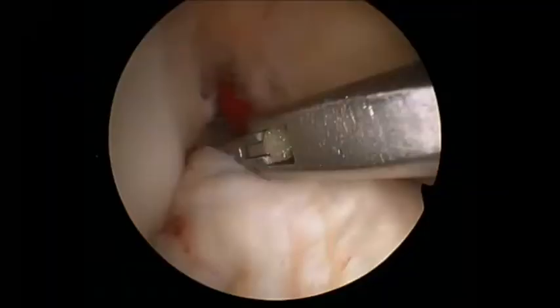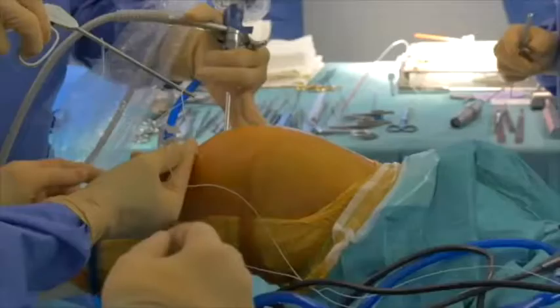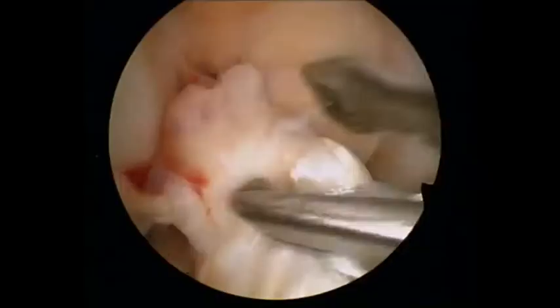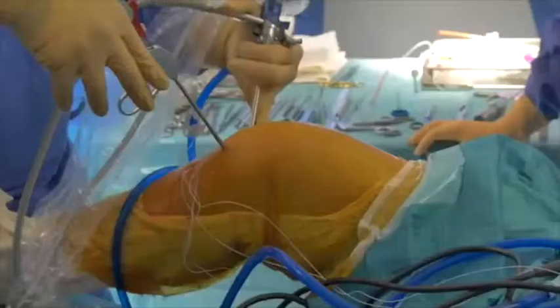Next, a fiber wire is passed through the proximal remnant in a luggage tag fashion using a scorpion suture passer. This step is repeated a second time using a second fiber wire, and both are retrieved out the medial portal.